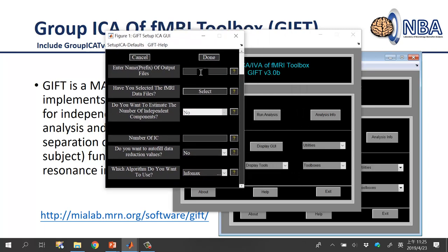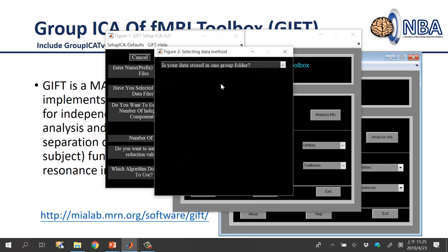The first field asks for a prefix — any characters you'd like to use as a prefix for output files. I typically use 'ICA' or 'G'. Do not use special characters like question marks or asterisks. The second section asks you to select the fMRI data files — click the Select button.